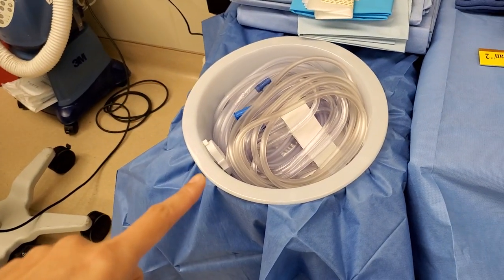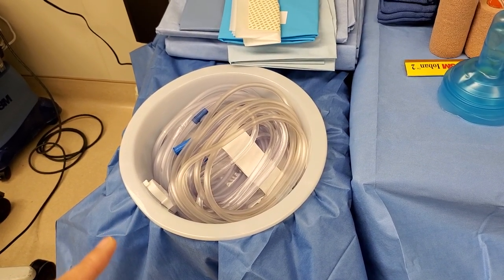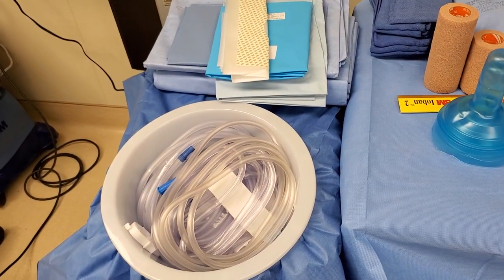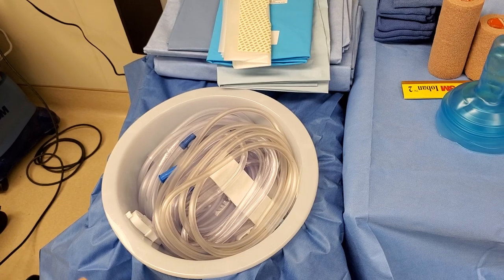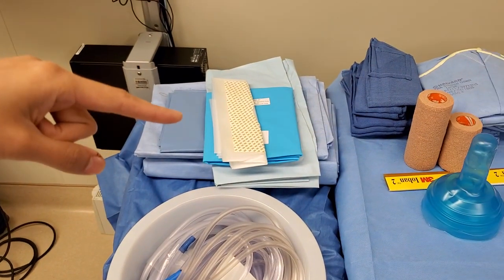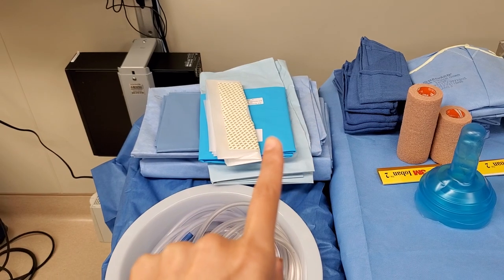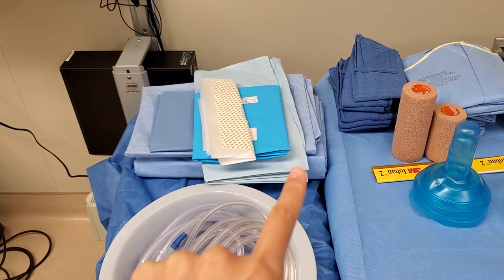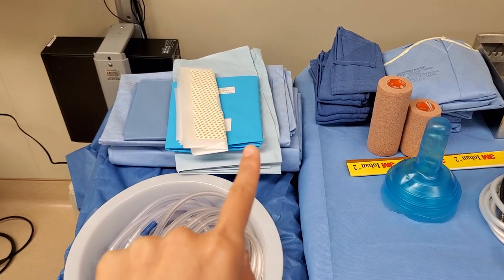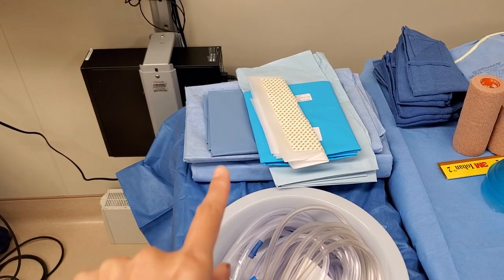I have a bunch of suctions here only because this is a heavily wet case where a lot of irrigation is needed. There are like three in there, but it's an arthroscopy pack so there are already existing suctions in there. This is a U-drape, another plastic U-drape, and the arthroscopy drape — somebody opened me an extra one. That's a half sheet and these are also two U-drapes.